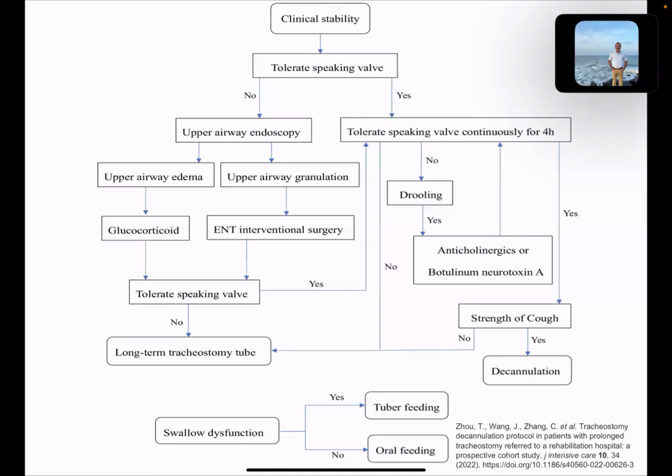So if the patient is like that, with the cuff deflated and swallowing good, I would say with a 7 you can directly cork the tracheostomy, block the tube, keep it for 48 hours, and then directly decannulate. And suppose the patient's general condition is traumatic brain injury or hypoxic, GCS is a little bit poor, and there is a chance of aspiration and pneumonia infection, then we go a little bit slow and reduce the size by 0.5, going up to 6. 6 is the lowest. You cannot go beyond that. Then you can give the blocking trial.